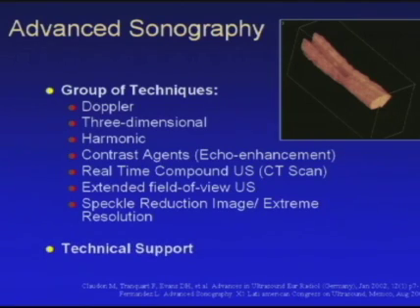It requires important technical support to perform these kinds of technologies because we need proper equipment, and somehow it has become a new specialty among sonographists and sonographers to be trained and have the capability to perform these techniques, advanced sonography.